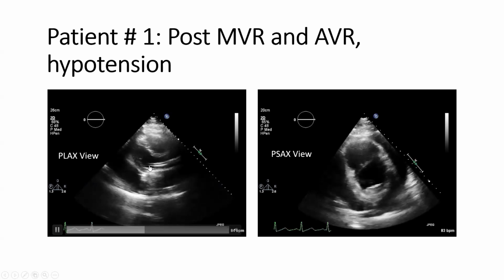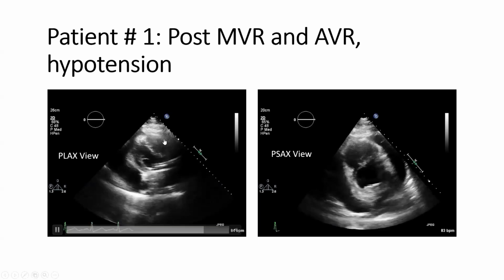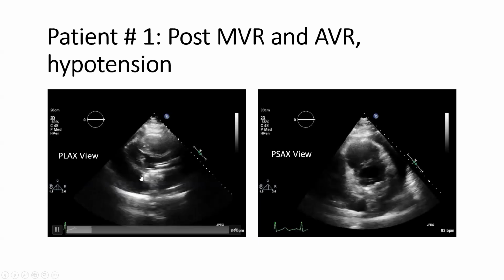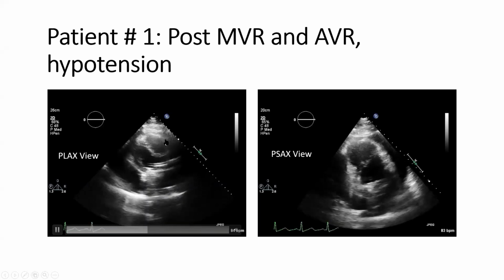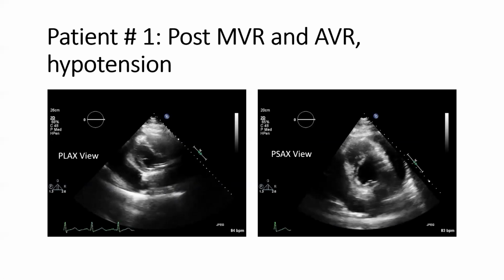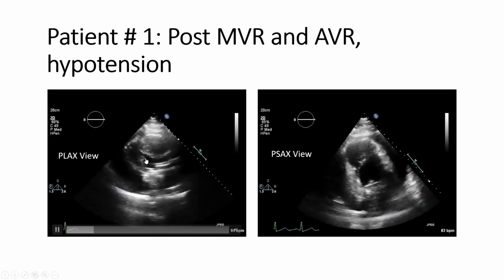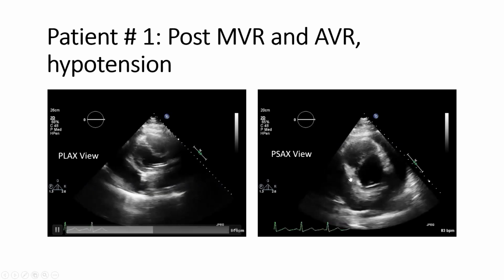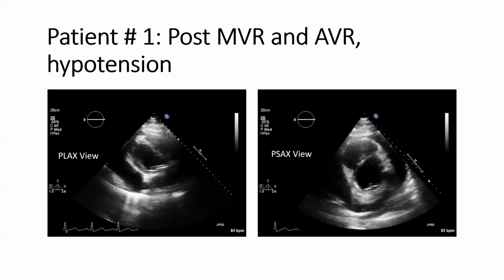This is very characteristic of what is referred to as ventricular interdependence. If you look carefully, the distance between the RV free wall and the posterior LV wall remains fairly constant because this fluid, the pericardial effusion, is under pressure, which is setting a lower limit and a fixed limit for the space that the two ventricles can occupy. If during inspiration, the RV is going to get bigger, the LV has to become smaller, which causes the septum to move chaotically.